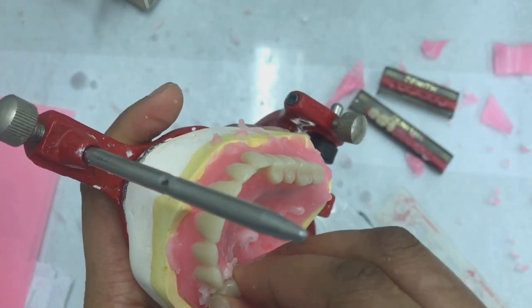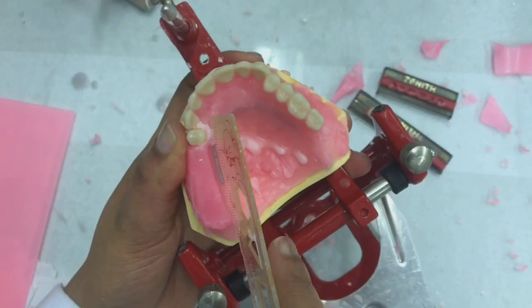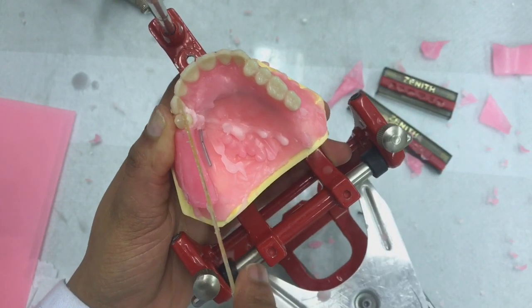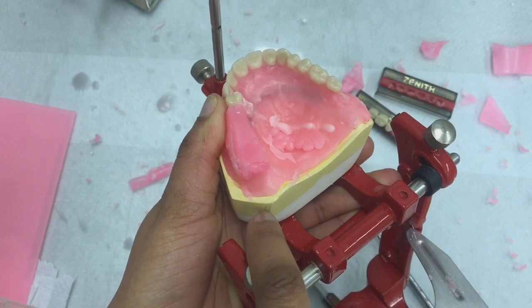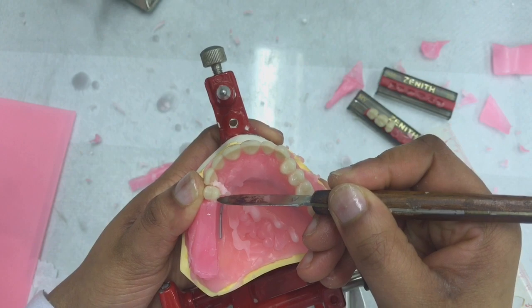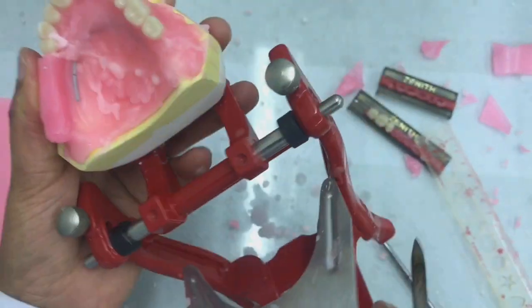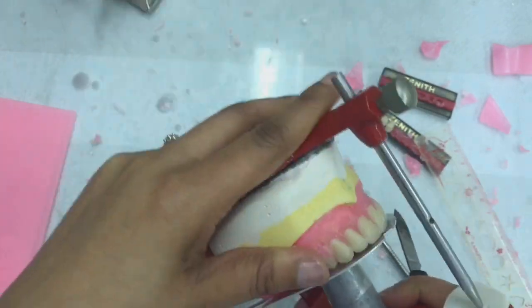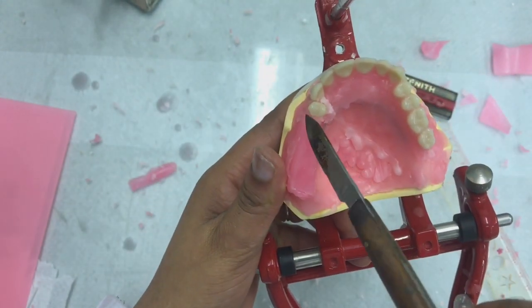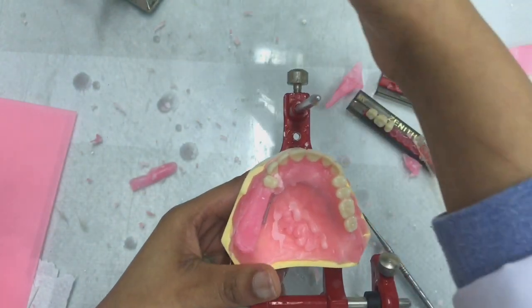Alright, just a reminder again that I want to position my premolar along the imaginary line that starts from the center of the canine's cingulum and will end at the 2 millimeter distal line that I have drawn. And remembering that I also want the lingual cusp to be off the table. So as I'm setting up, I can tell already that I'm again going to have to remove some of that wax there, otherwise it's going to obstruct my view.